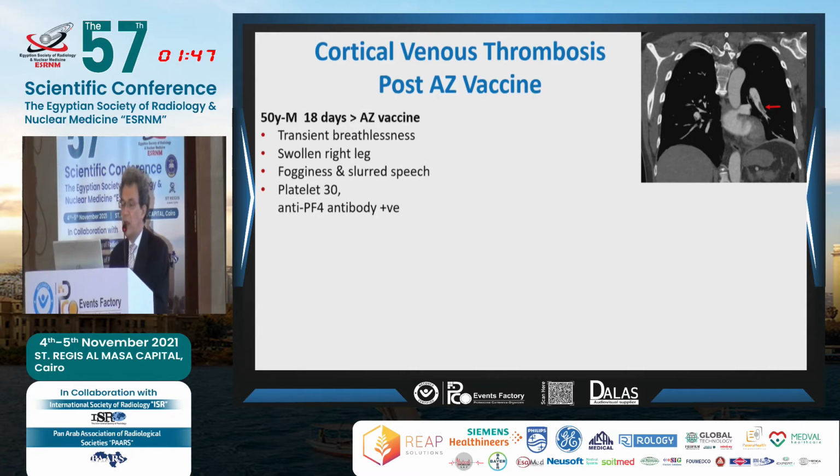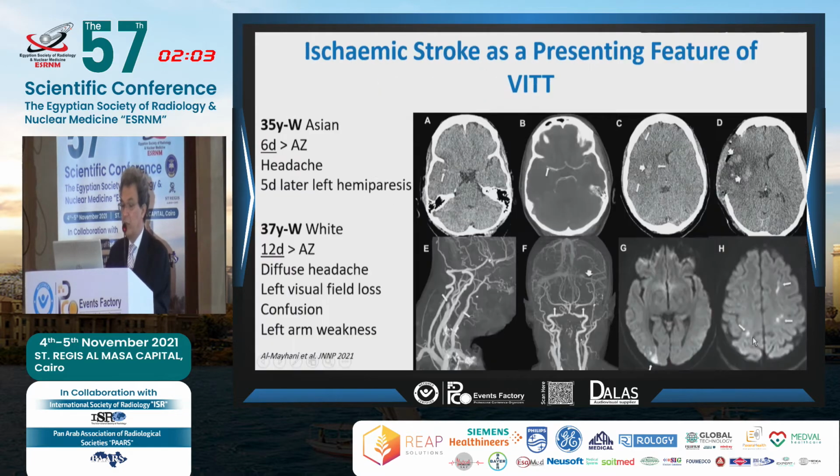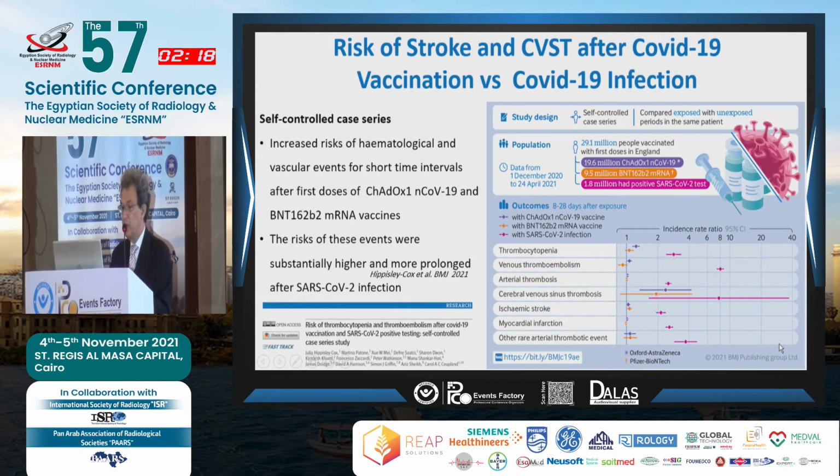What about the thrombosis? So you see here a patient with a thrombus, and in the brain, the trick now is to see where it is. It's not the sinus, it is the cortical veins with a venous infarction and the associated hemorrhage. Not only venous thrombosis, but also ischemic stroke can present, as you see here, occlusion of the MCA with an infarction and hemorrhagic transformation. And here some border zone infarctions.